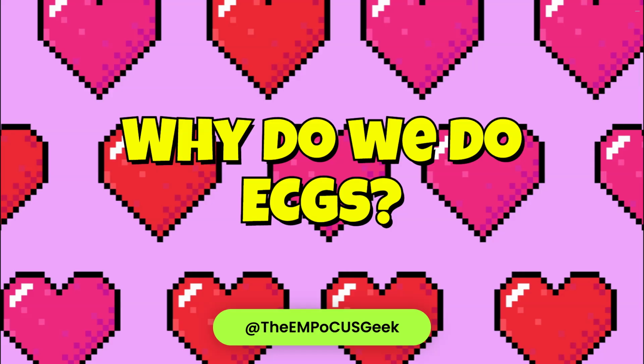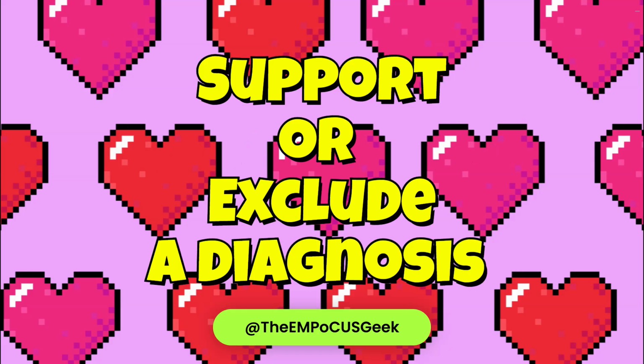So, why do we do ECGs? Now, diagnosis of medical conditions mainly relies on a good history and a good examination of the patient. So, the ECG is a tool, an investigation that can be used to support or exclude a diagnosis.